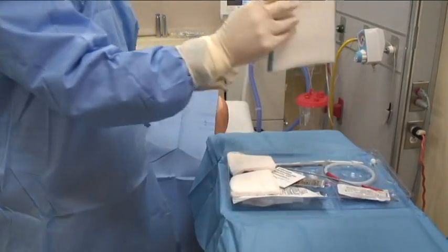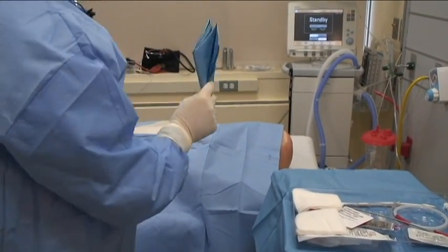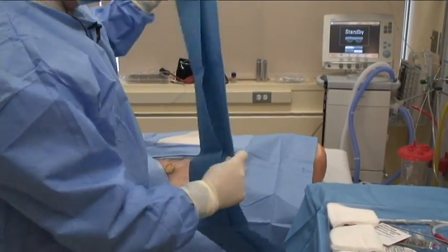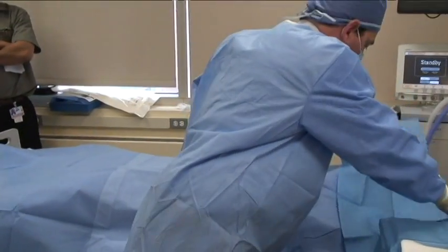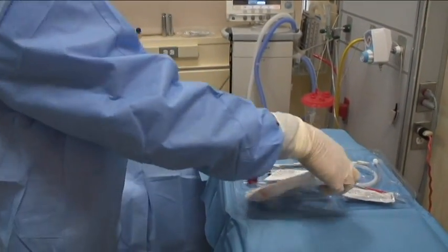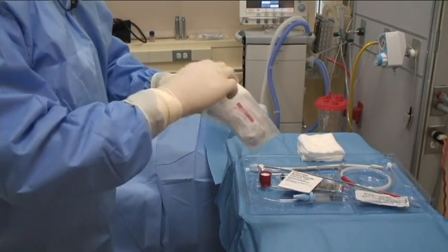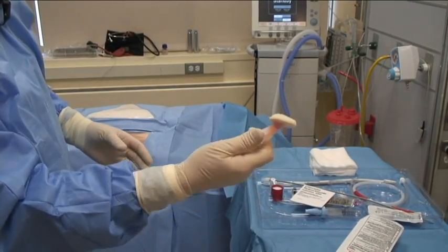My kit comes with a sterile drape as well. This is small, and we prefer to use the full sterile drape here. But you can use this if you want to for an extra area of sterile field if you'd like, but it's unnecessary. We have gauze in the kit. I like to put that on the side here. It comes with an extra chlor prep, which we can use if you want to keep it extra clean. And again, this is the type where you break by squeezing the two tabs.